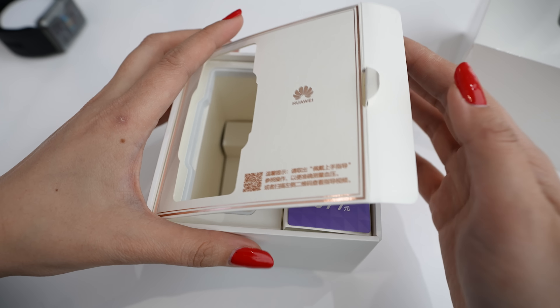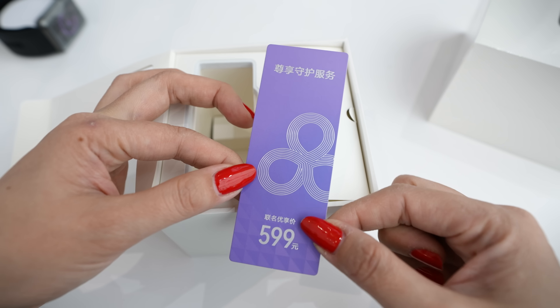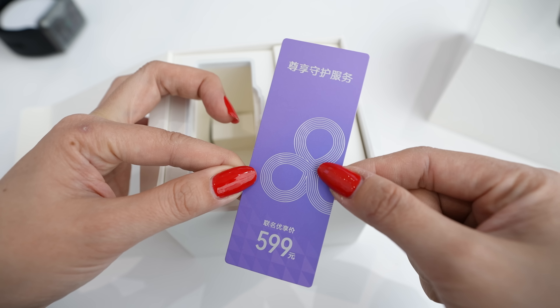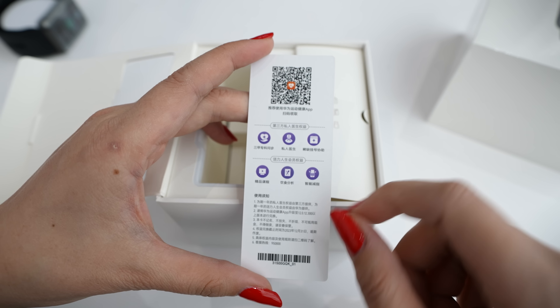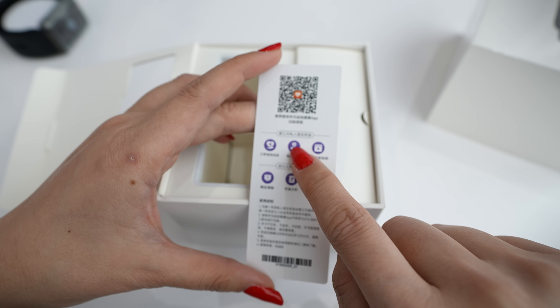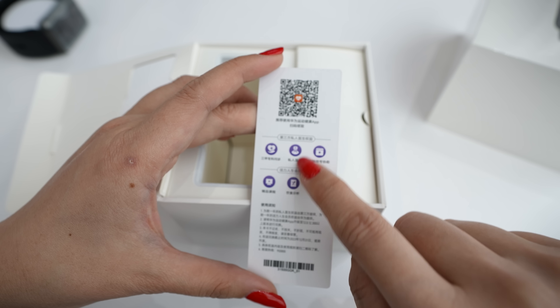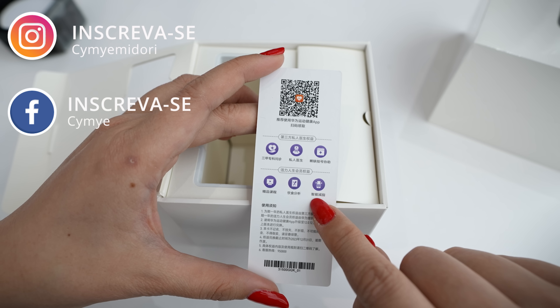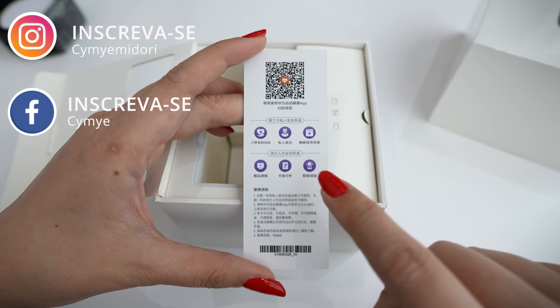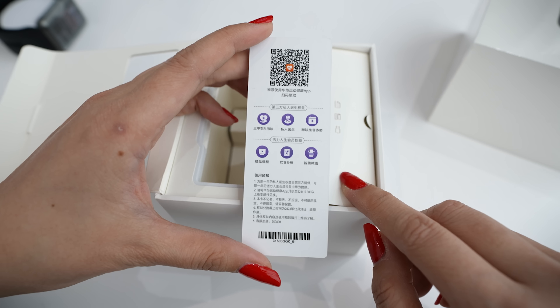It has a divider part inside our box, and there is a discount card for you to use the medical services they will offer. I found it very cool because on the back they say that you will have access to contact a private doctor who will check your weight, diet, and many other things based on the data that the Huawei Watch D provides.